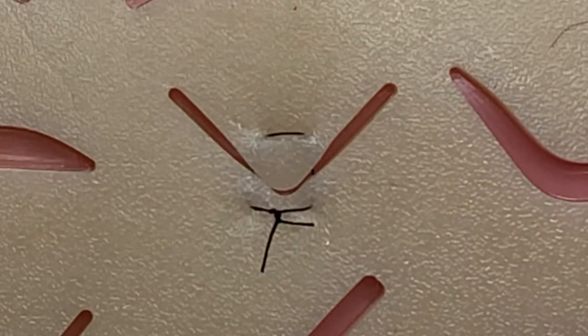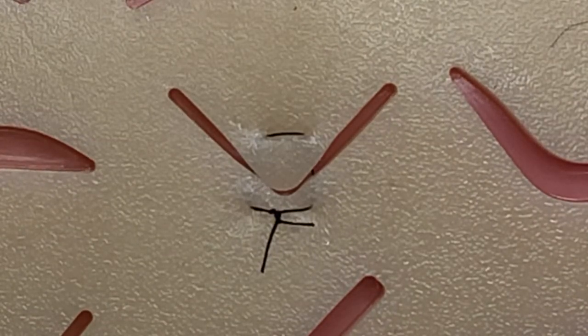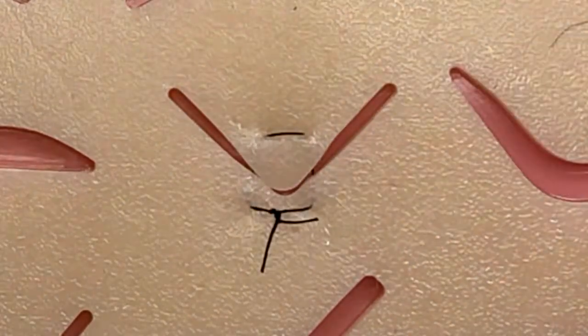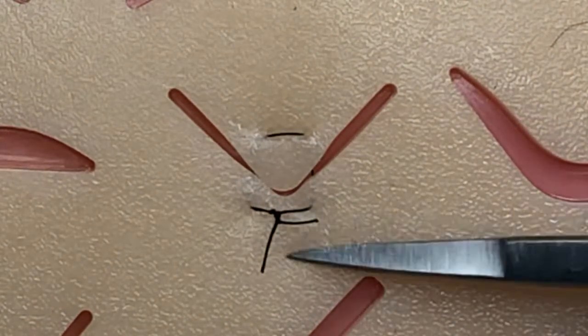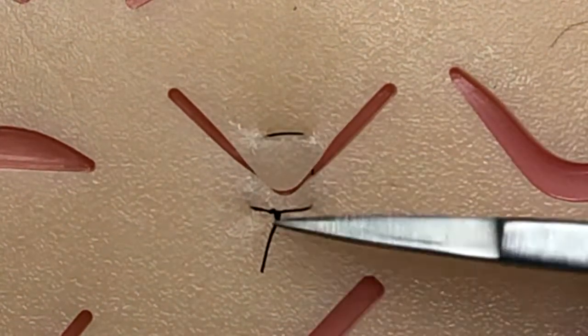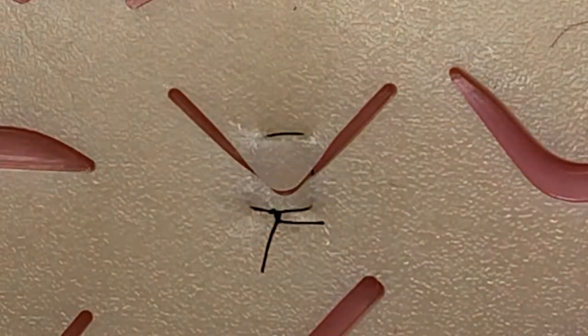All right, there you go, folks. So we have two ways to approach the V-shaped laceration: one with a single suture across the apex, and another with the horizontal mattress.